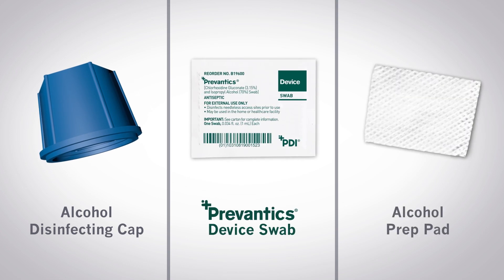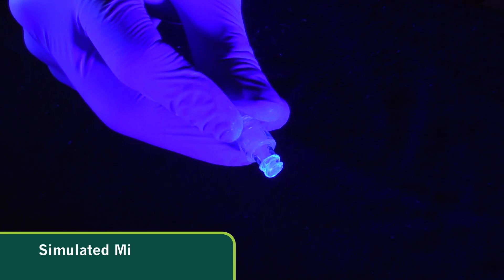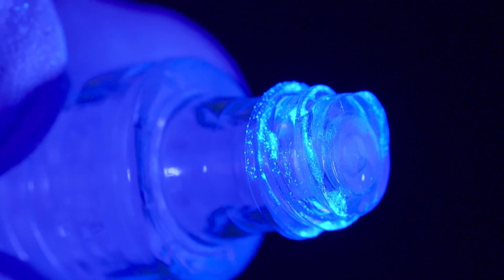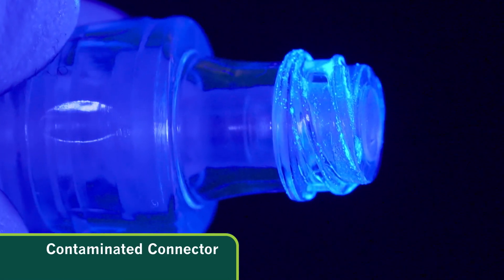Let's take a look at the different methods of disinfection. For this demonstration, microorganisms are simulated by the introduction of a bioluminescent product onto the device. The areas that are contaminated light up when shown under the blacklight.